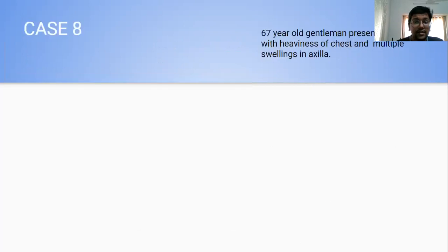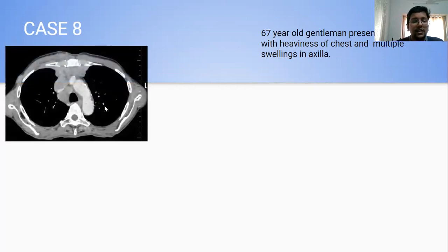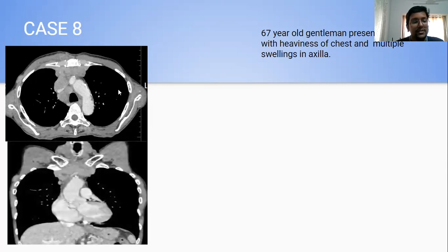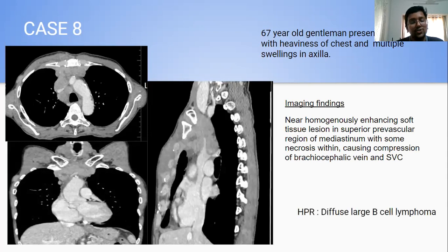My eighth case was a 67-year-old gentleman who presented with heaviness of chest and multiple swellings in the axilla. CT revealed near-homogeneously enhancing lesions involving the mediastinum with mediastinal lymph nodes, compressing the SVC as well as the brachiocephalic vein with no evidence of infiltration. There was no calcification, no necrosis, and no bony erosions at all. This turned out to be diffuse large B-cell lymphoma.